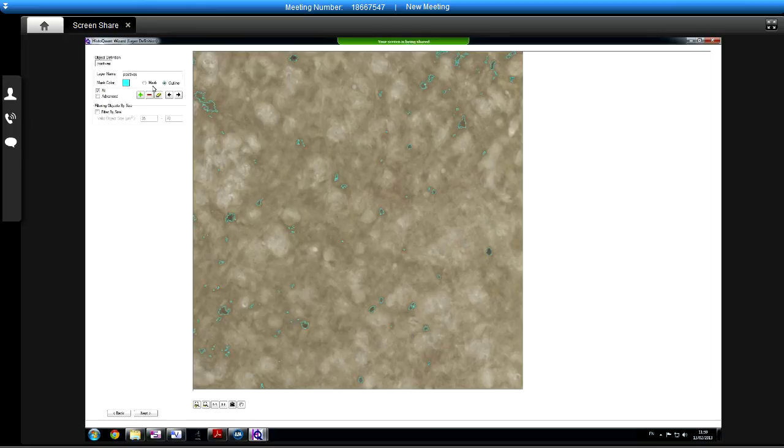How's that now? What about this one here? Well, that looks like the upper limits. Maybe just up a little bit. Interesting. Okay. That's good. That's now better than we had before.